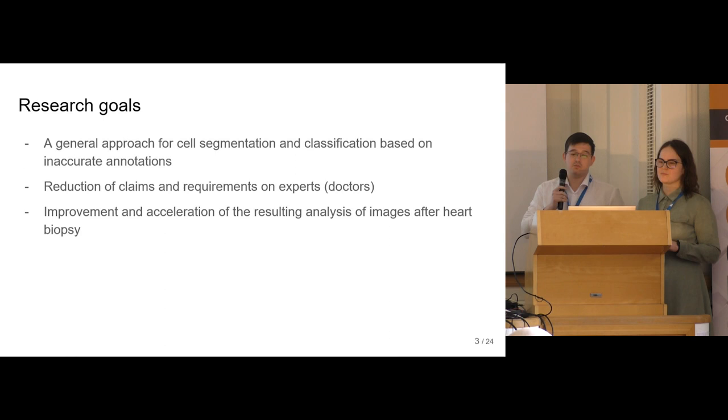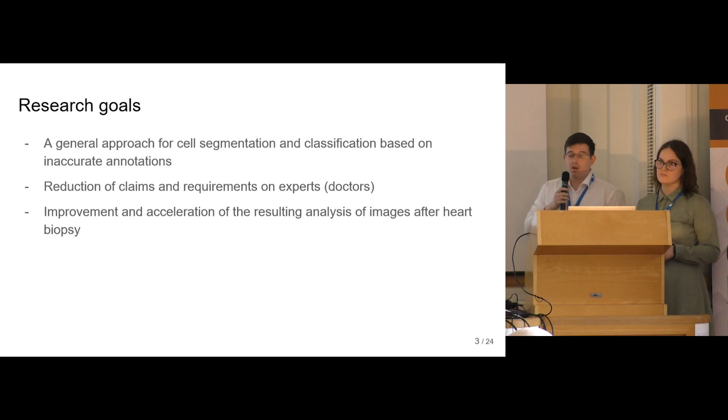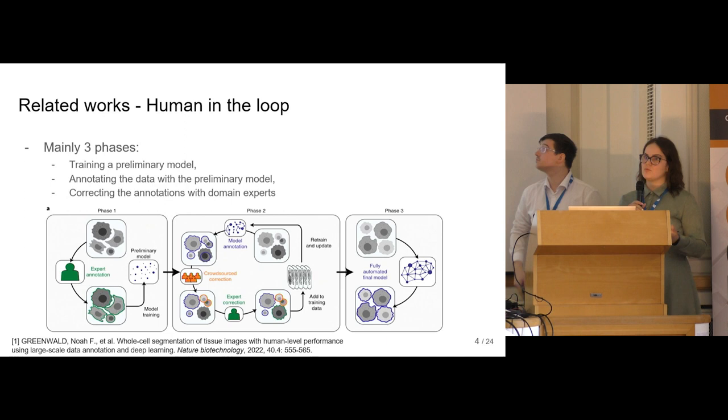In our work, we are focused on creating a general approach for cell segmentation and classification based on weakly annotated data and inaccurate annotations. Our next objective is to reduce the demands and requirements on domain experts, which are in our case doctors and pathologists, where we are trying to use as few annotations as possible to train the model for nuclei classification. And finally, we would like to help pathologists to improve and accelerate the resulting analysis of images after heart biopsy.